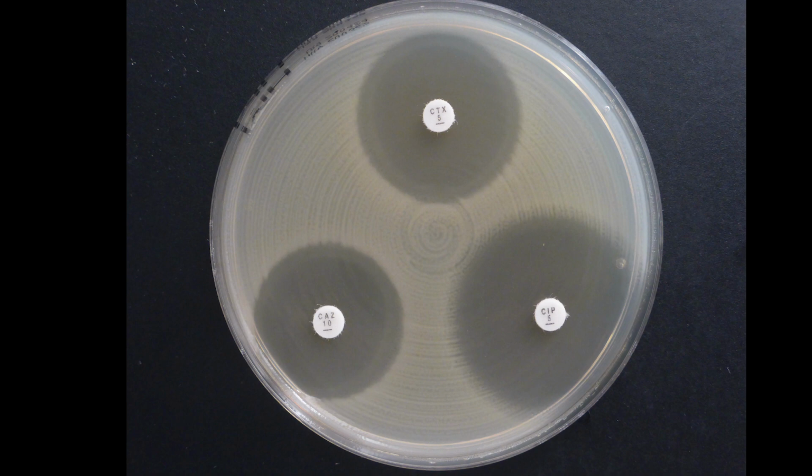As you see, we have 6 different agents here that could have been limited to 4. That would have been enough. And each row here corresponds to one person. And of course, the person performing the reading exercise, or the one being an expert in disk diffusion in the laboratory, should also read the zone diameters.